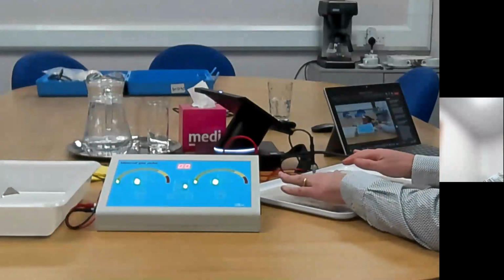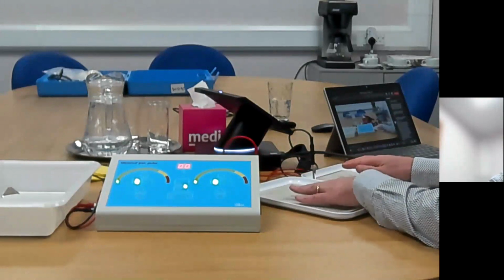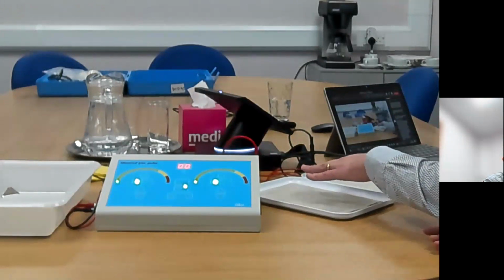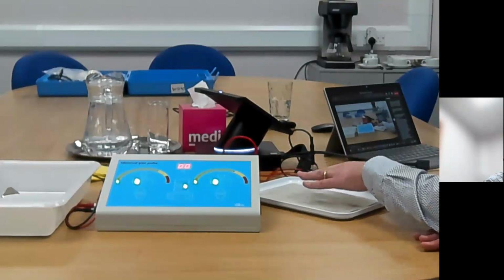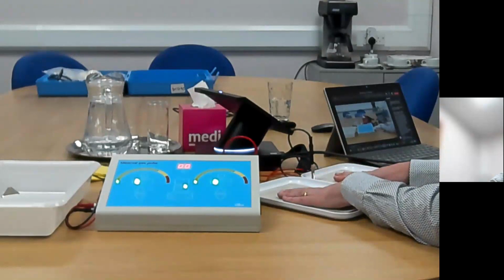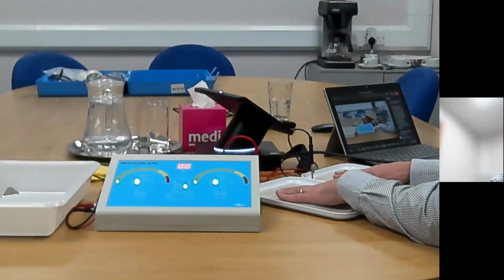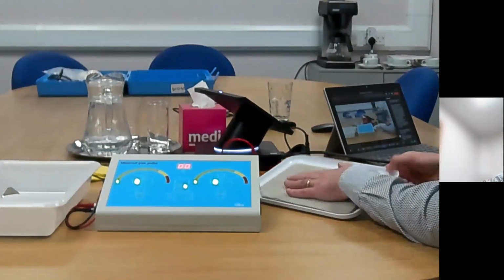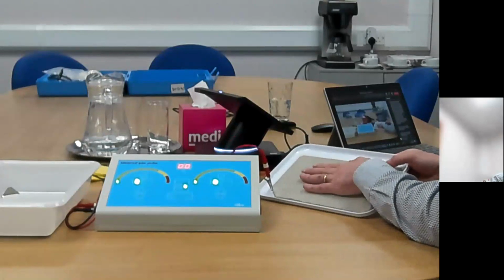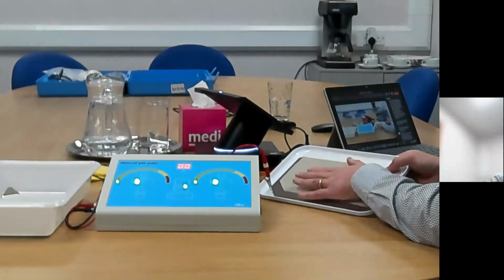It's a good idea to have the patient sitting so they're comfortable and they can rest their arms on the table. Sometimes people will get a rolled up towel to put under their elbows just so it's a little bit more comfortable, because remember, the patient's going to be sitting here for around about 20 minutes. They should be just resting their hands lightly on the grills. You should make sure that the hand is on the plastic grill, that the grill's not been displaced and the hand could be making direct contact with the metal, because if that's the case, there'll be a concentration of current and you could get skin burns.